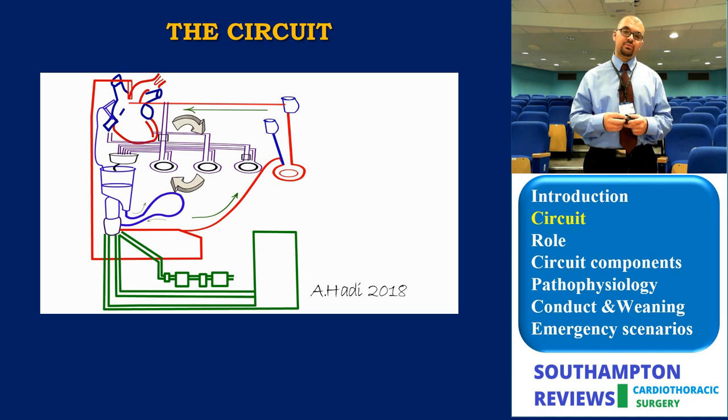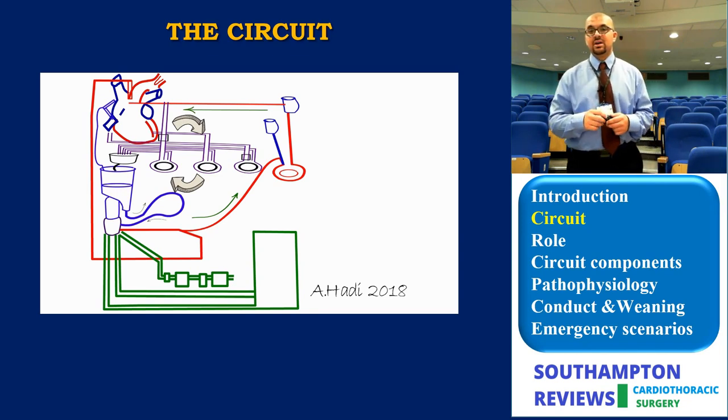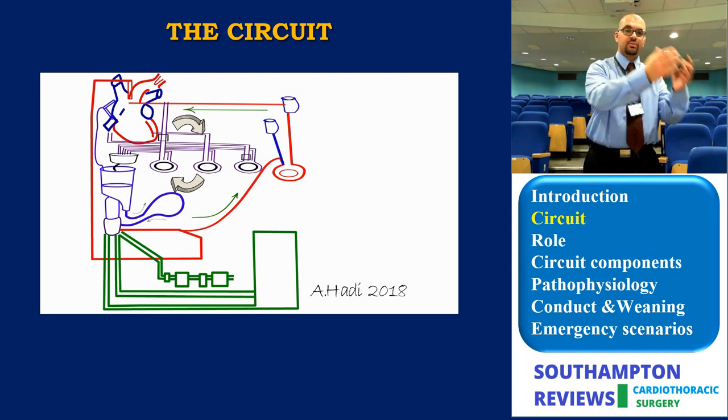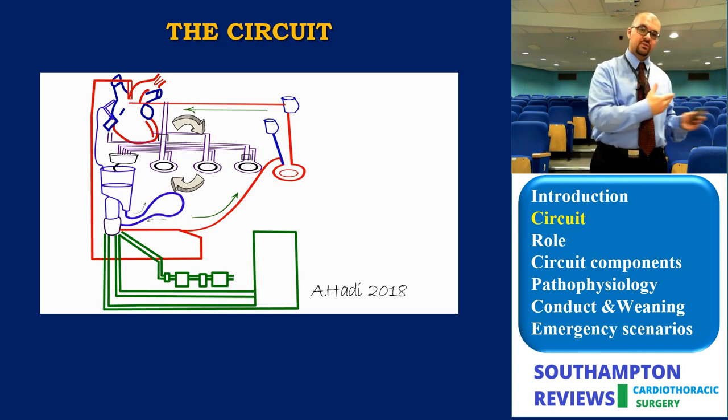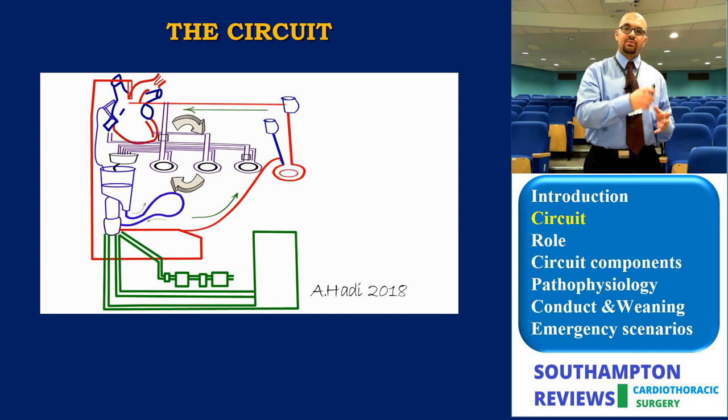Another point of importance in the hierarchy of this circuit is, for instance, the position and direction of the vents. It's not unheard of. Wrong alignment or wrong connection of the vents can kill a patient simply because the vent is meant to draw blood from the surgical field to the reservoir. Remember, the top part of the reservoir is air. So imagine if you put it in the other direction, so the circuit rotating the other way.